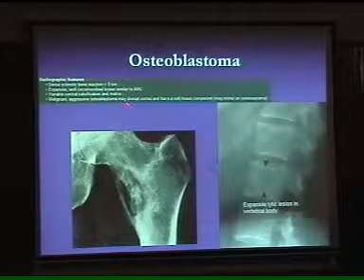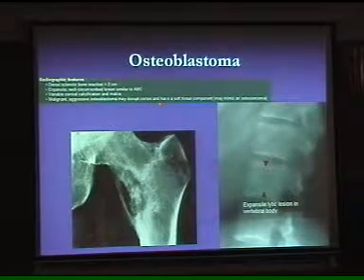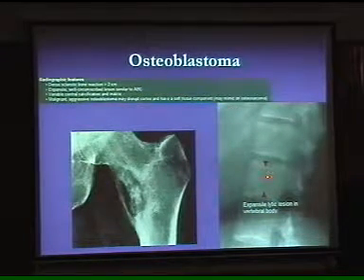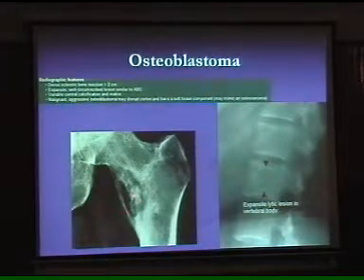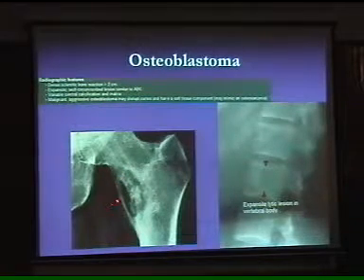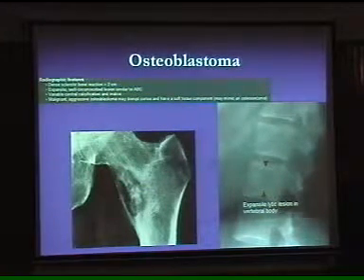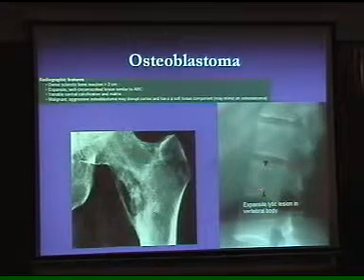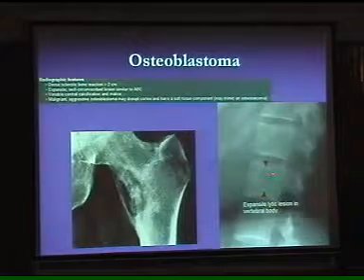Malignant aggressive osteoblastoma may disrupt the cortex, very rarely. It has a soft tissue component which may be involving outside it, like you can appreciate here. If it grows outside the cortex, damaging it and the soft tissue, that becomes the aggressive nature. If you limit it to this osteoblastoma, which has not become aggressive and malignant, it so far looks benign in nature.